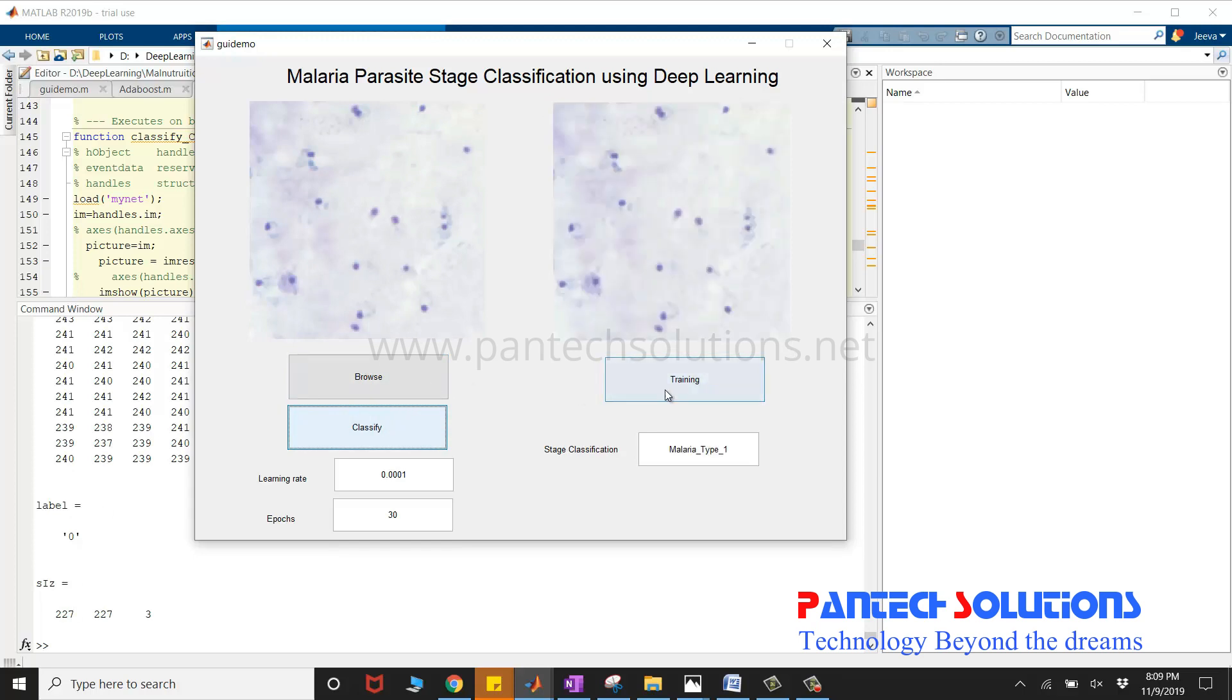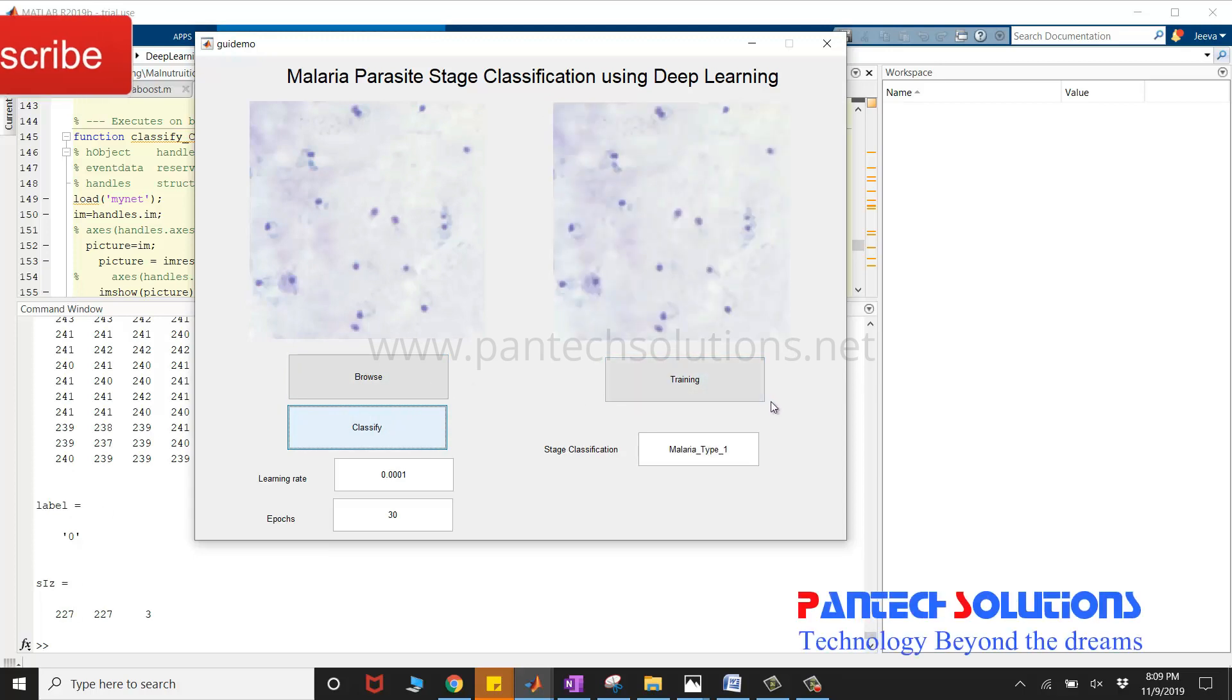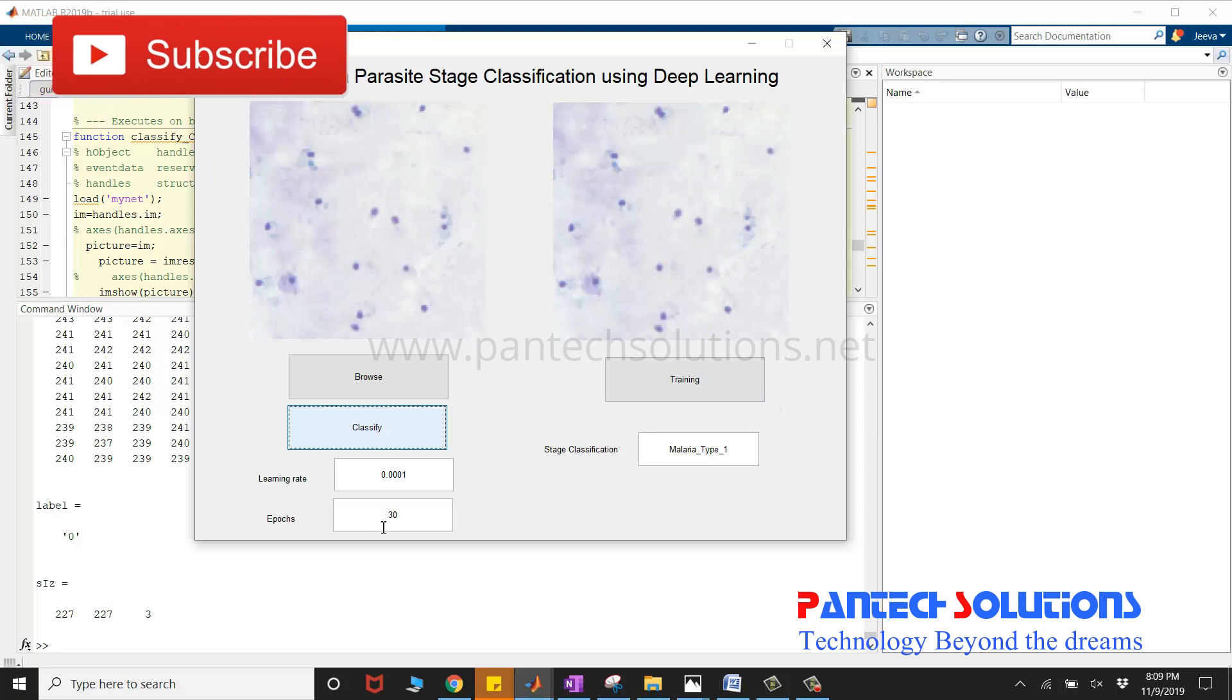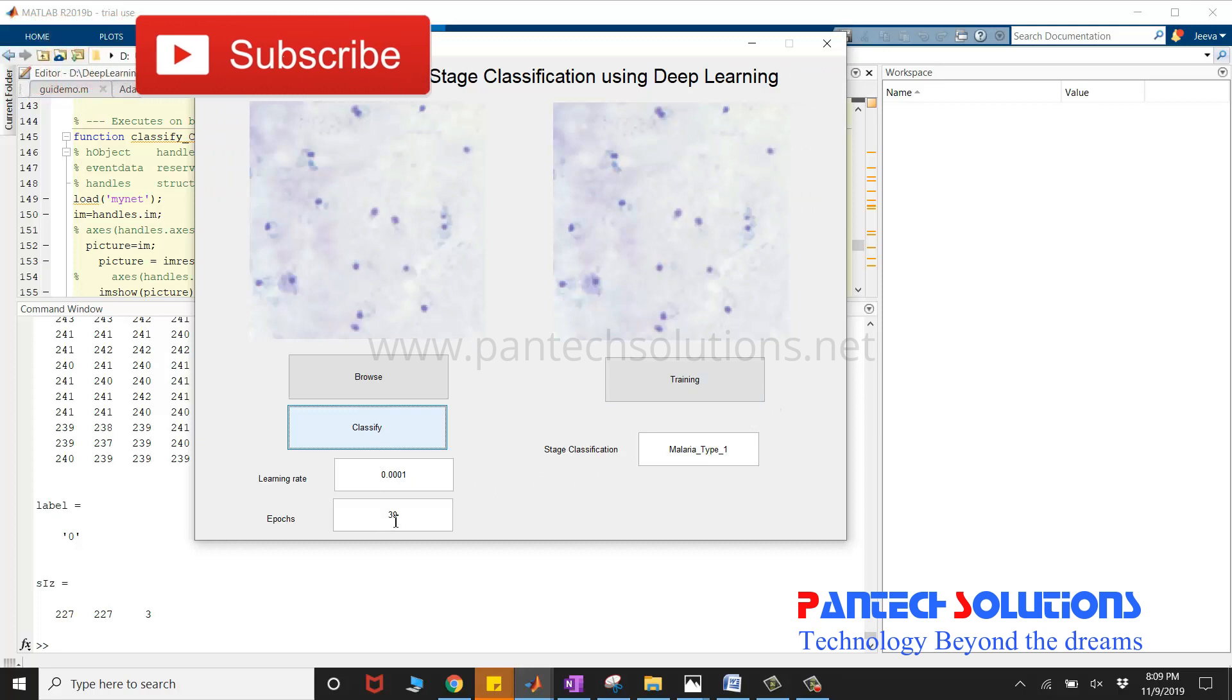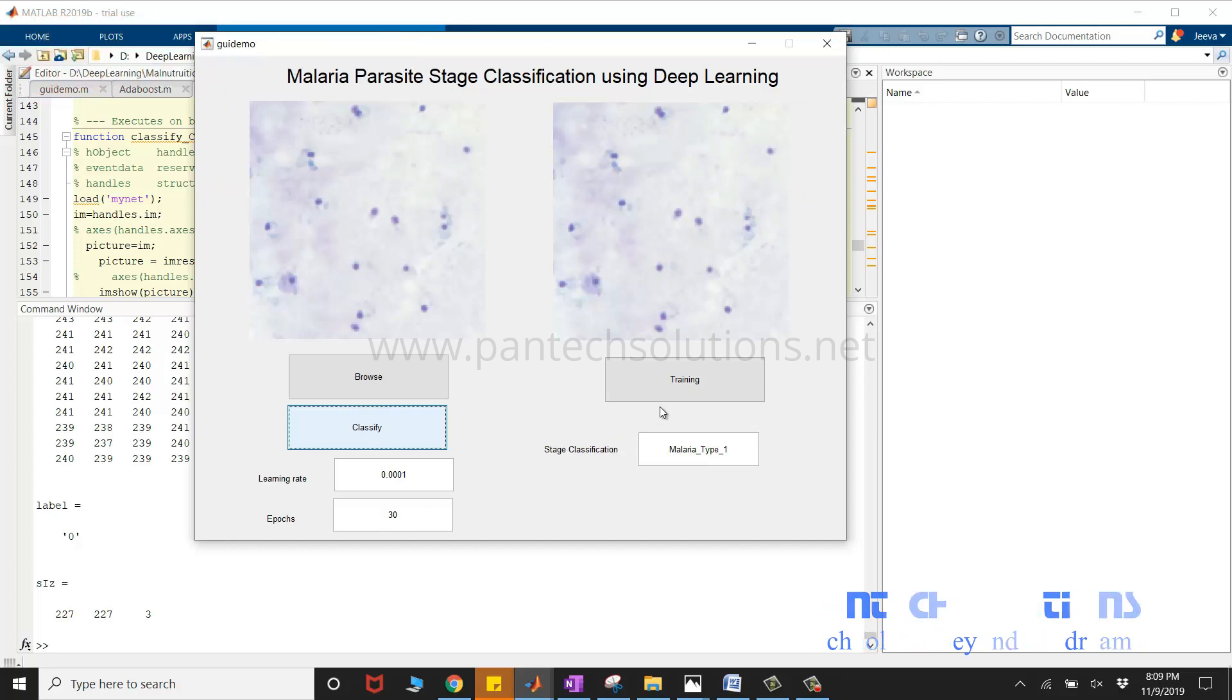There is a button called training, which is used to train the datasets with various learning rates and epochs. I'm not going to click training as it is going to take more time.